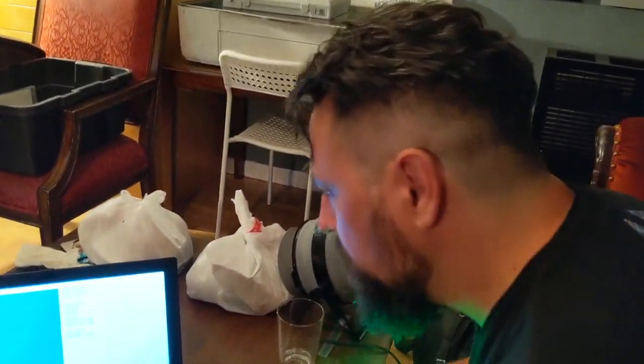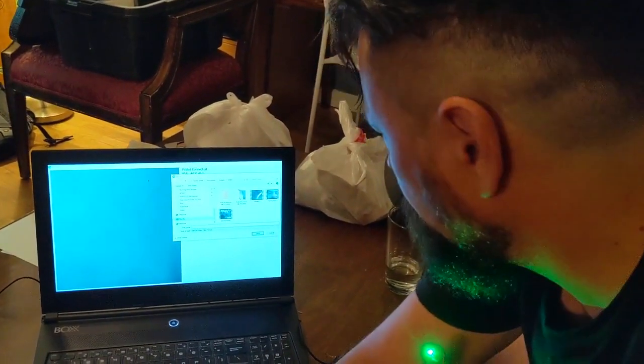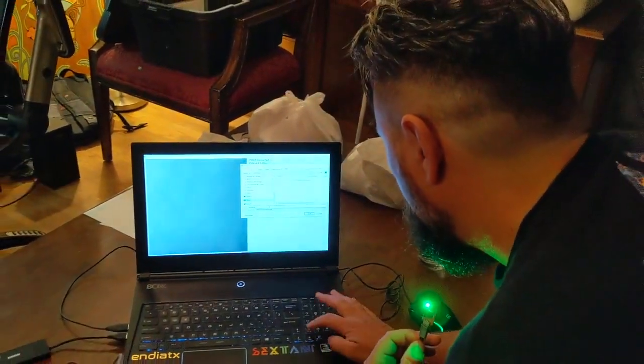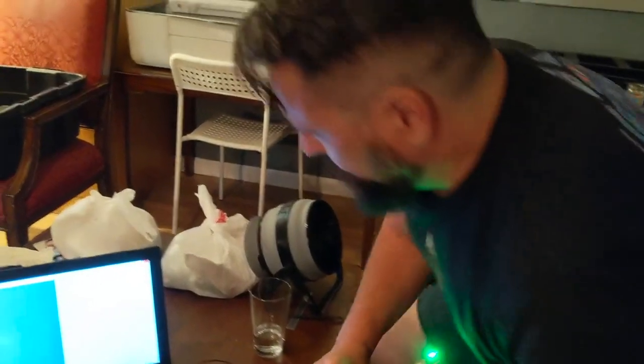Oh, we're just headed down. Alright, it's a process. We're gonna put this over here. Let's go save. Let's start a little video here. PillBot connected. Inside Tori. Let's get the file name of one. And save. So now it's gonna be recording here. PillBot inside Tori.